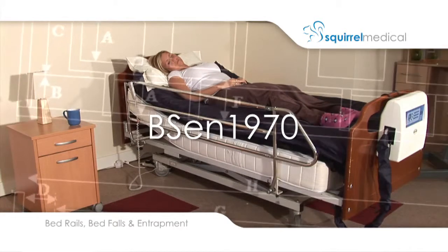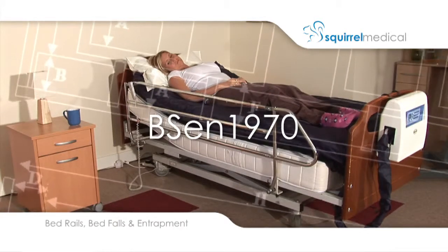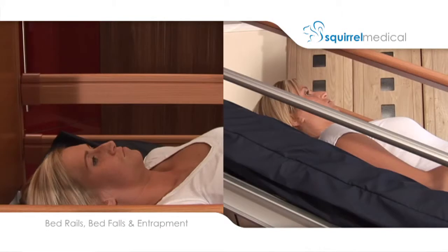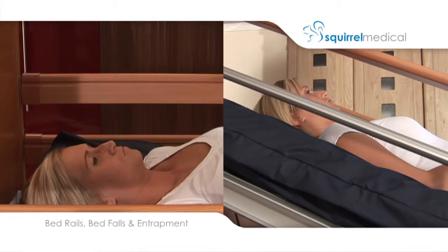Safety standard BS-EN 1970 gives a specific set of criteria, including heights and widths of bed rails. The first critical measurement pertains to the height of the bed rail above the uncompressed mattress. It requests a height of 22 centimeters or greater from here to here for full length, or from here to here for split bed rails.